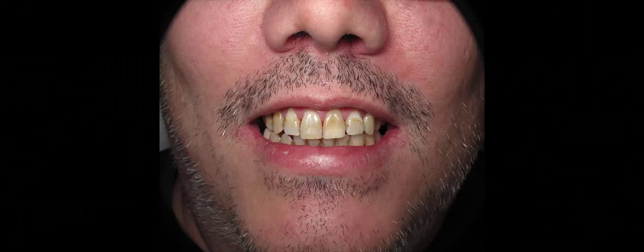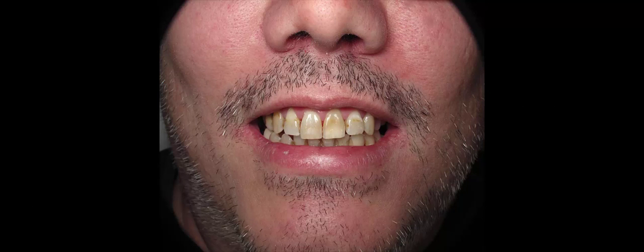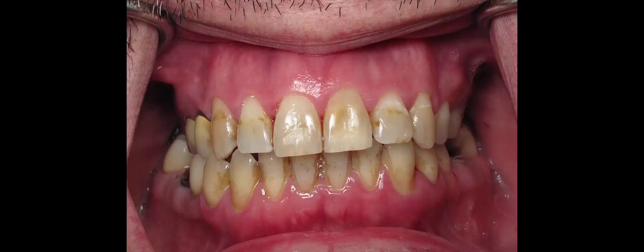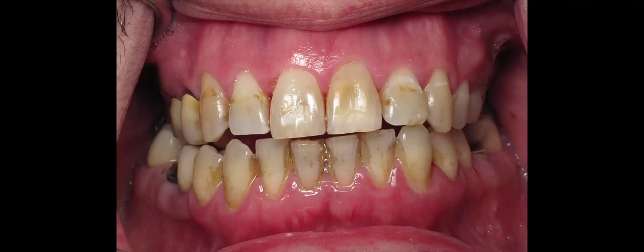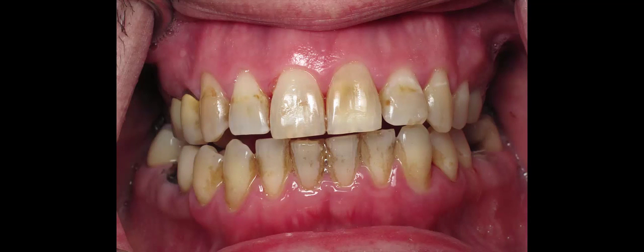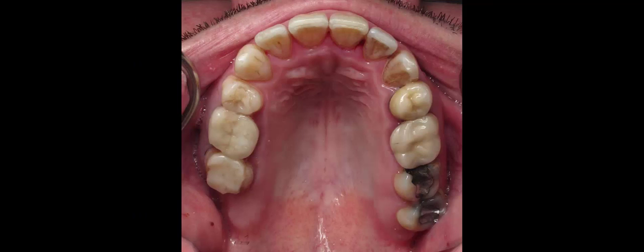The patient's smile shows some heavy staining, may have some tetracycline staining of his teeth. That's his smile. With the lips retracted, you can see some of the teeth broken off at the gum line in the back, and a collapsing bite that happens when you lose a tooth.